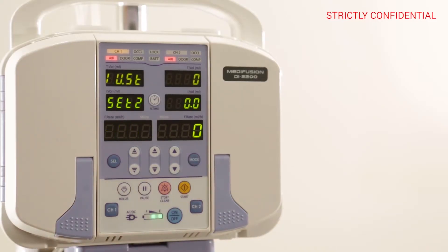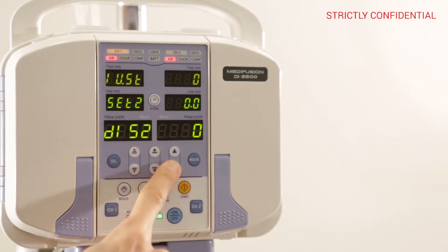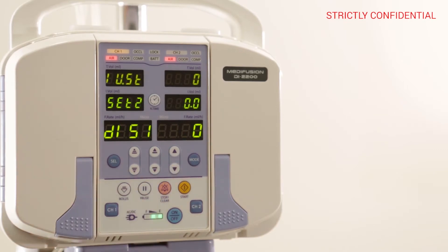Press the MODE button once to switch to SET 2. Then use the arrow keys to find D1-S1 and press the BOLUS button to complete the setup.